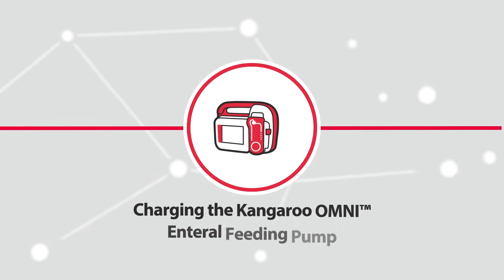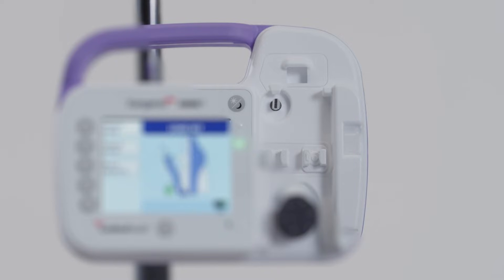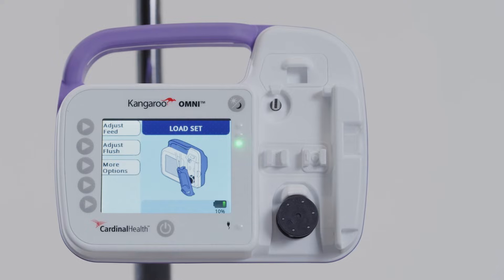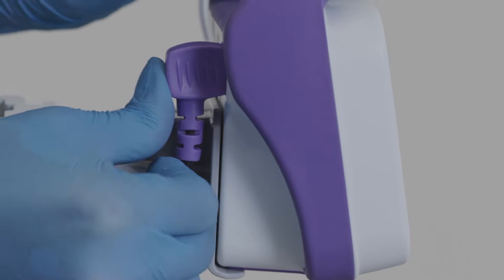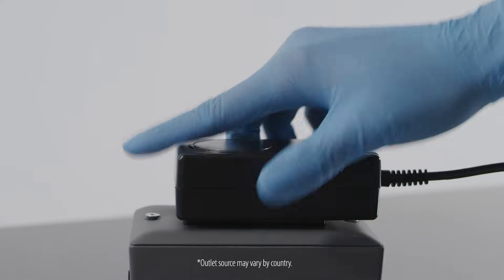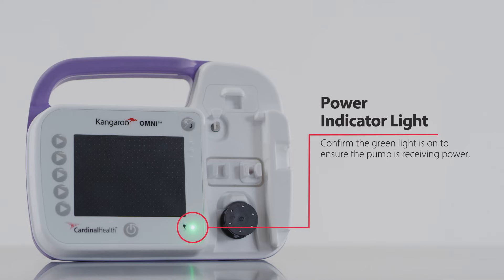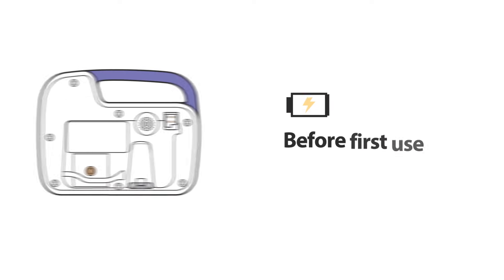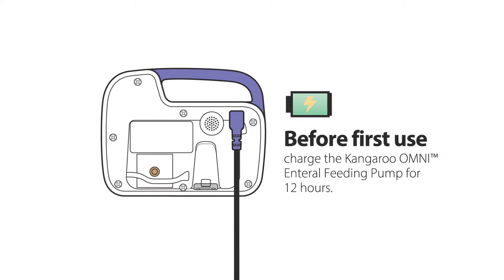Charging the Kangaroo Omni enteral feeding pump. Before you begin using the pump, you will need to be sure it is fully charged or connected to a power supply. To begin, plug the power adapter into the power adapter port on the back of the pump, then plug the other end into a nearby electrical outlet. Confirm the green power indicator light is on in the bottom right of the pump. Before first use, charge the pump for a minimum of 12 hours.